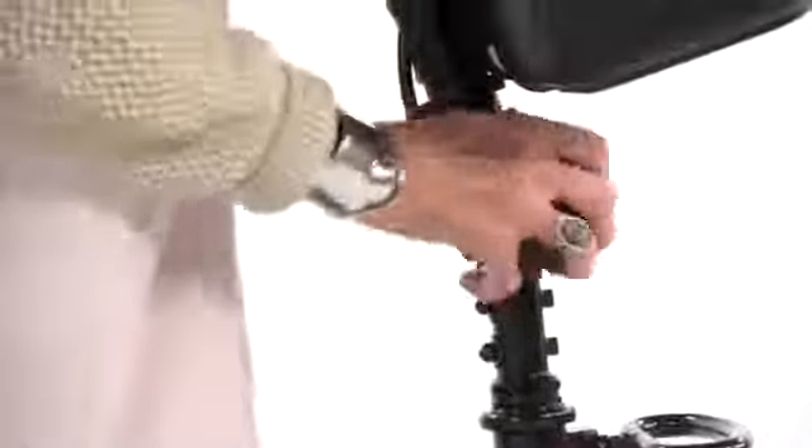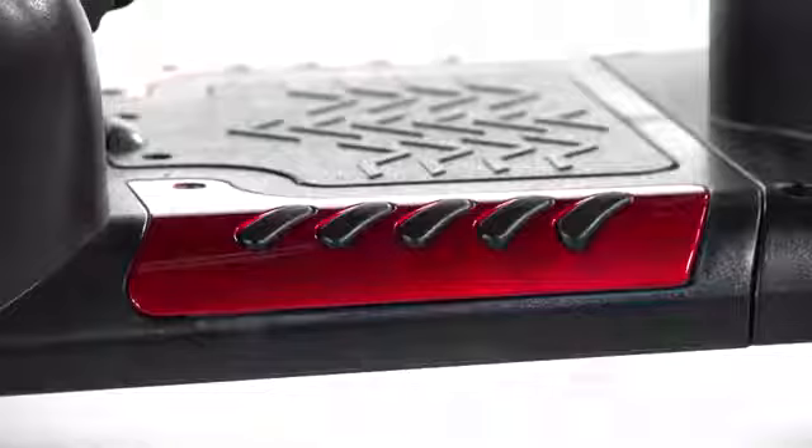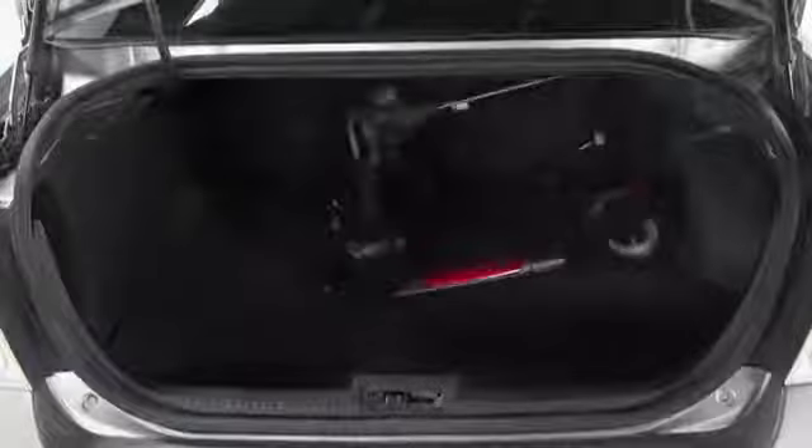The Phoenix HD three-wheel is not only safe, it's stylish, with interchangeable panels in red and blue allowing you to customize for your style and attractive two-tone seat upholstery. You can always count on Drive Medical to bring you convenient and innovative lifestyle solutions, now and for the road ahead.